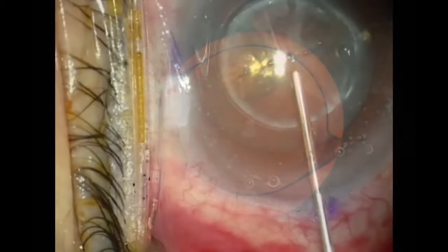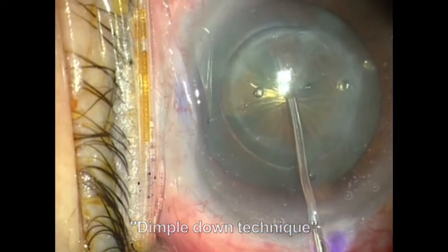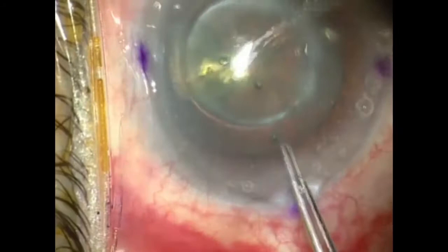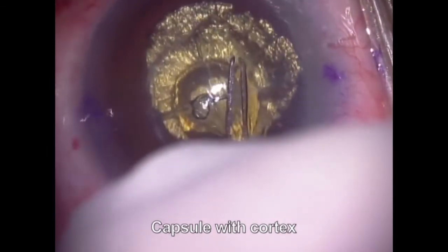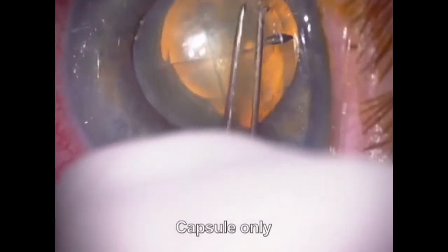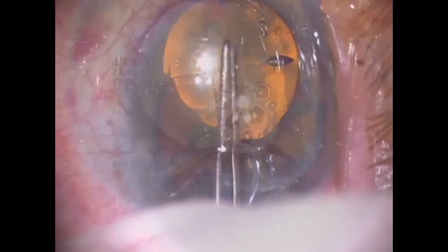And now, on to femtocapsulorhexis and its problems. Here we see the dimple down technique taught to us by Burkhard Dick to free and remove the completely cut anterior capsule, which is now the norm for current generation femto machines. If the cut capsule with underlying adherent cortex is grabbed with a capsule forceps, a thick, odd-looking capsule results. Picking up only the capsule results in a more normal-looking capsular flap.